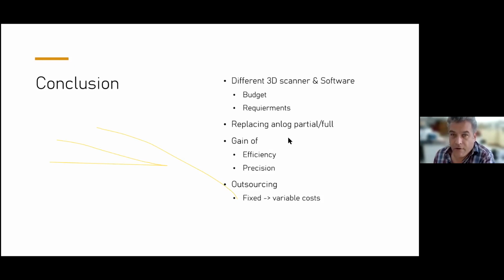I don't have to sit half an hour or 1 hour to deflask something, to clean, to take the plaster out, and so on. Maybe there's a bubble or something, I have to fix it. It's very precise, and the efficiency is a minimum of 50% higher than analog.